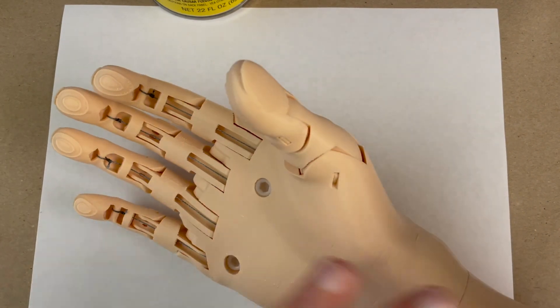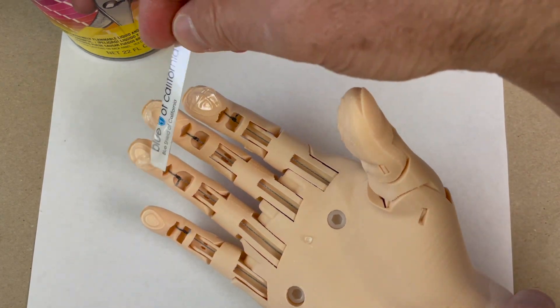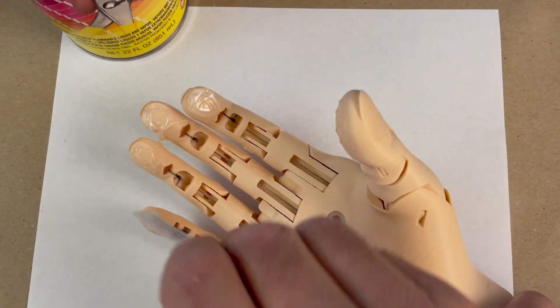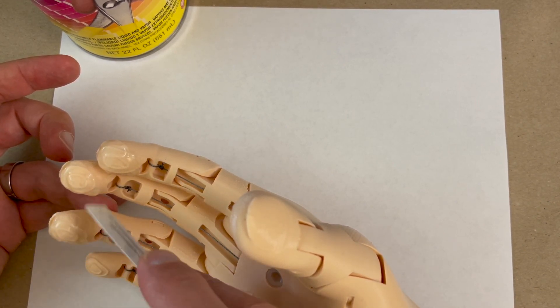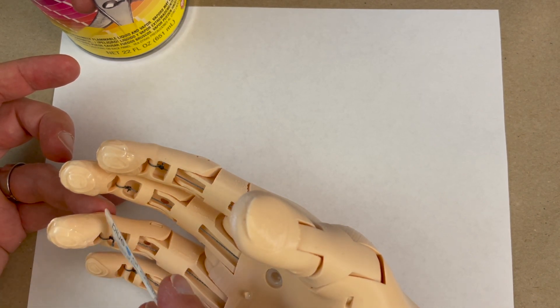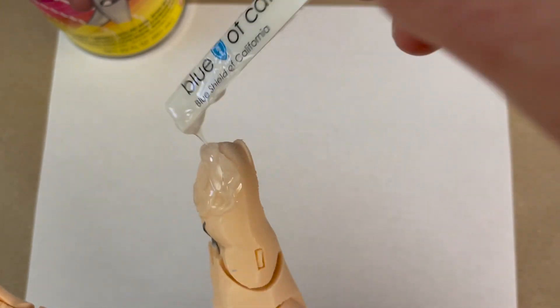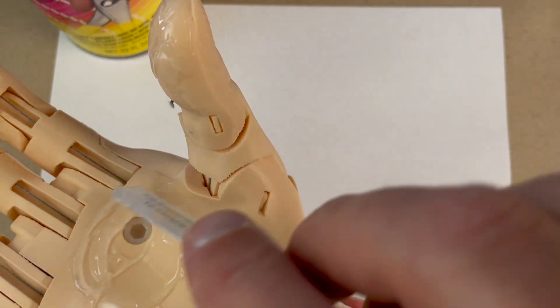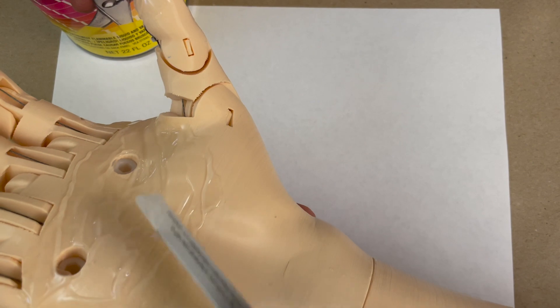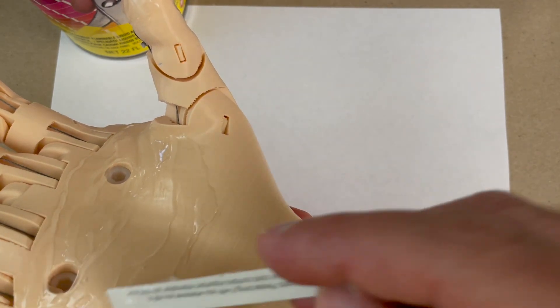I'm spreading the Plasti-Dip itself all over the fingertips and all over the palm. I'm putting plenty on — really gooping it on. I don't want it to be perfectly smooth; I really want it to provide an uneven, gripping surface. You can use a brush to put this on more smoothly, but it'll ruin the brush each time, and I actually don't want it that smooth anyway. I prefer to use a piece of cut-up plastic card — old credit cards or a health insurance card — to smear the Plasti-Dip.